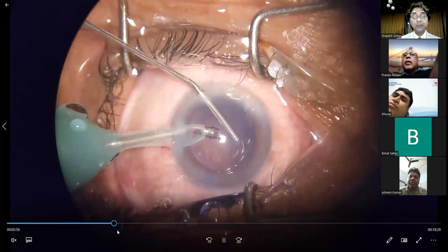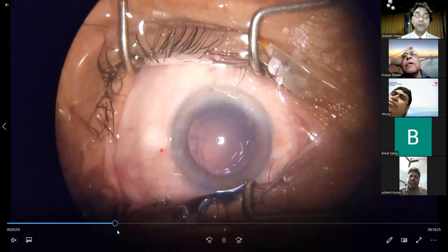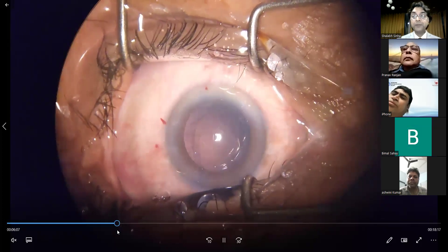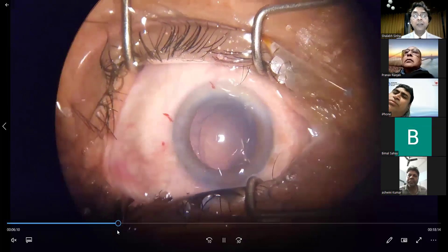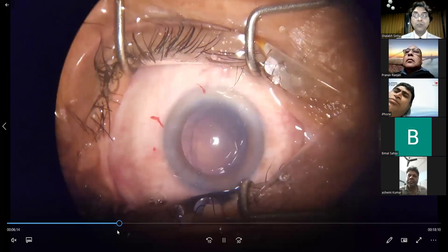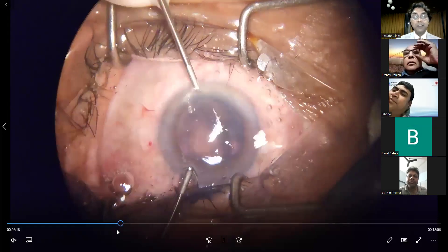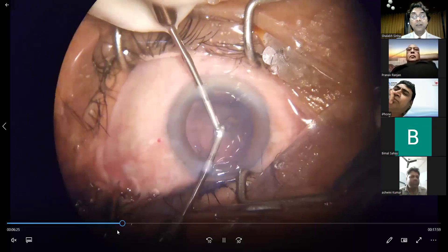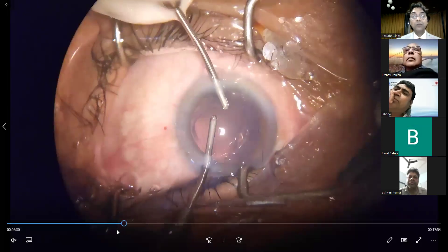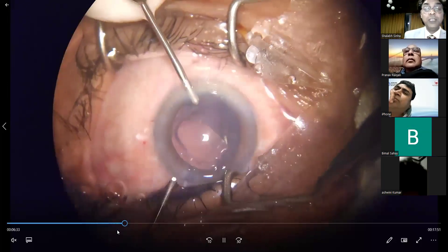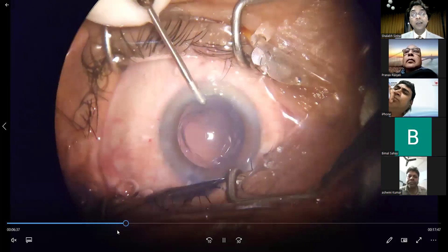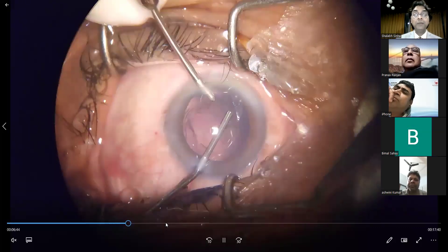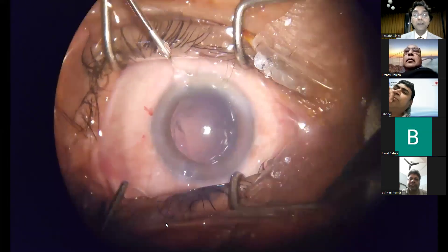The PCR has already occurred but I haven't noticed it yet. I routinely inject viscoelastic from the side port before removing the phaco tip — that is done as a routine in almost every case, irrespective of whether there is a PCR, just to maintain the anterior chamber. During bimanual irrigation-aspiration I hadn't noticed the PCR, but suddenly it becomes visible. The hydration of the vitreous took the anterior hyaloid forward, and now the posterior capsular rent with the vitreous collapsing into the anterior chamber is visible.